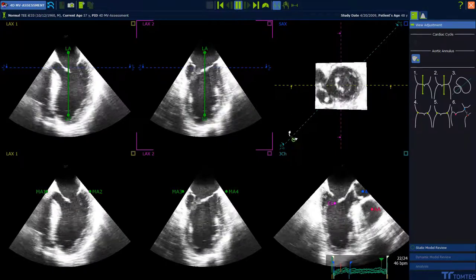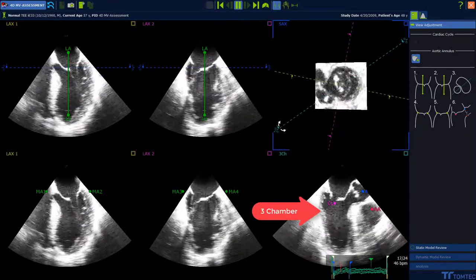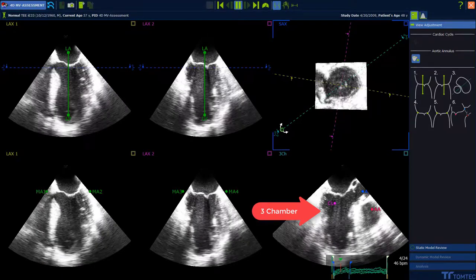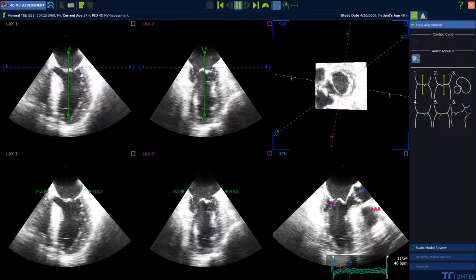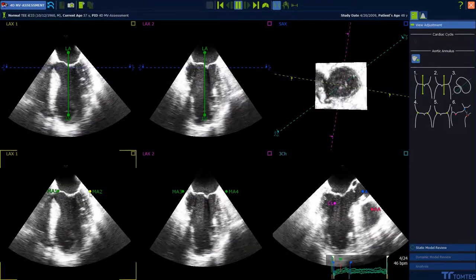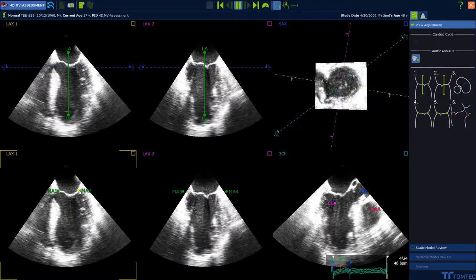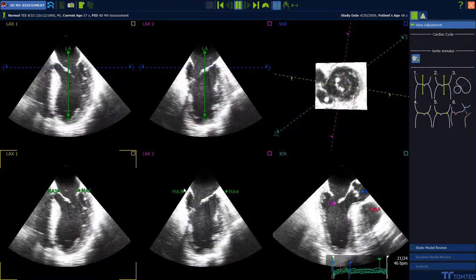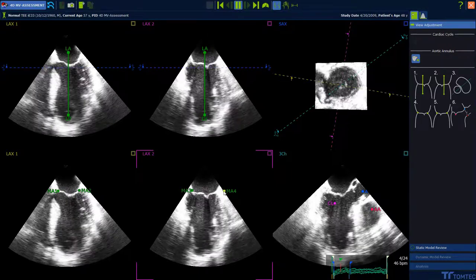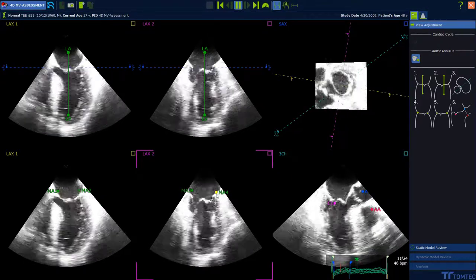Adjust the long axis orientation. Rotate the midline until you can see a three-chamber view on the lower right. Position all four mitral valve annulus points by drag and drop. Then go over to the three-chamber view next to the right.